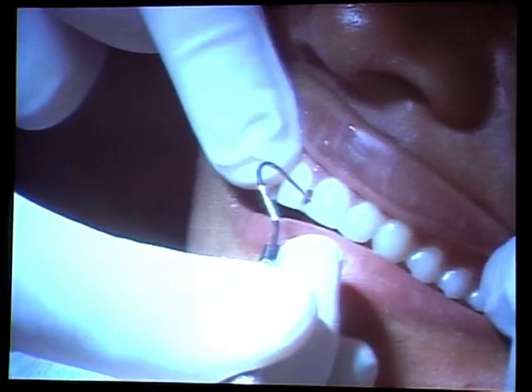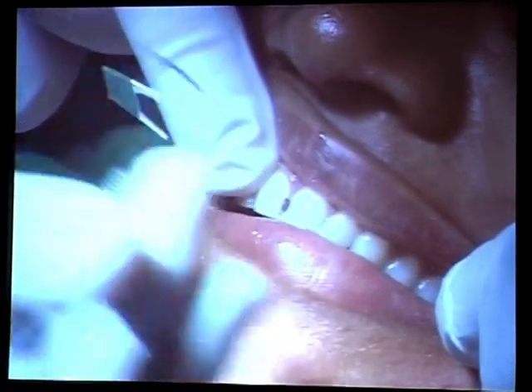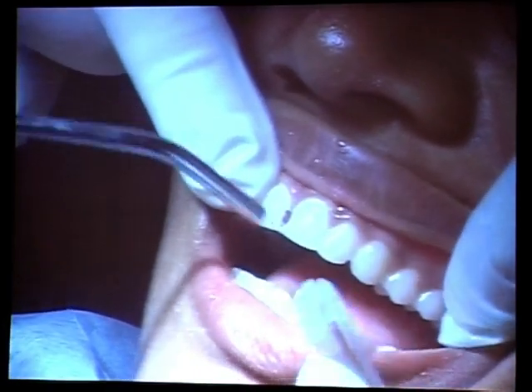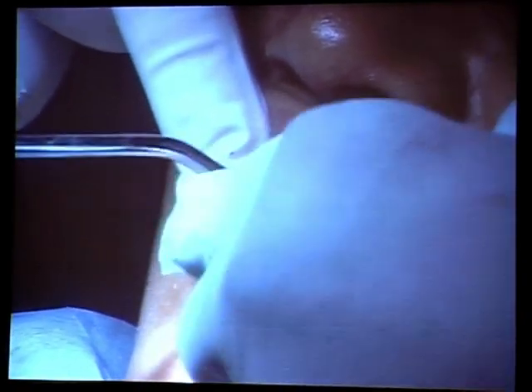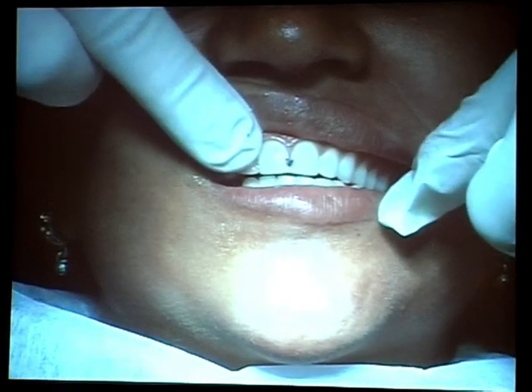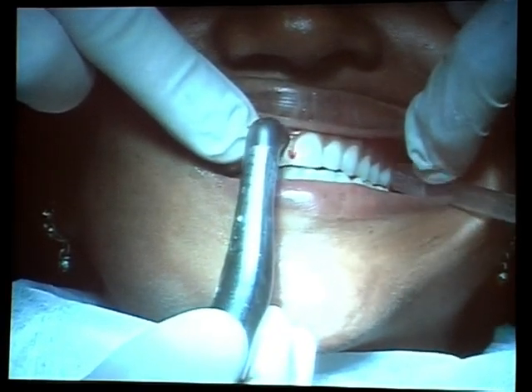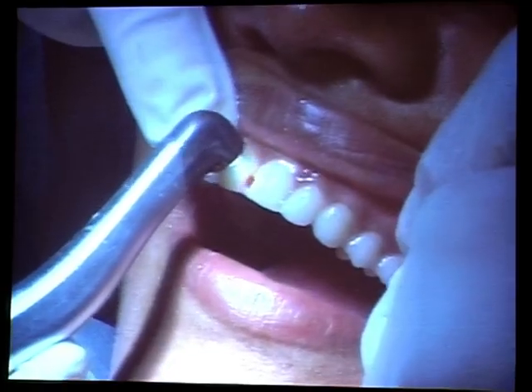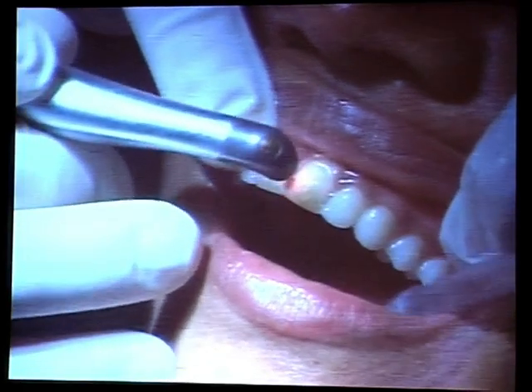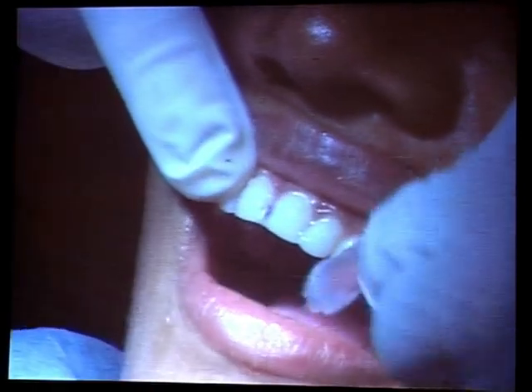It takes a little getting used to because we as dentists are used to touch and feel. They're very touchy-feely people. And when you have to use something in a non-contact mode, it takes us a little while. There is a learning curve to it, like there is with everything in life. Okay, we're nearly finished. Should we do the rest?